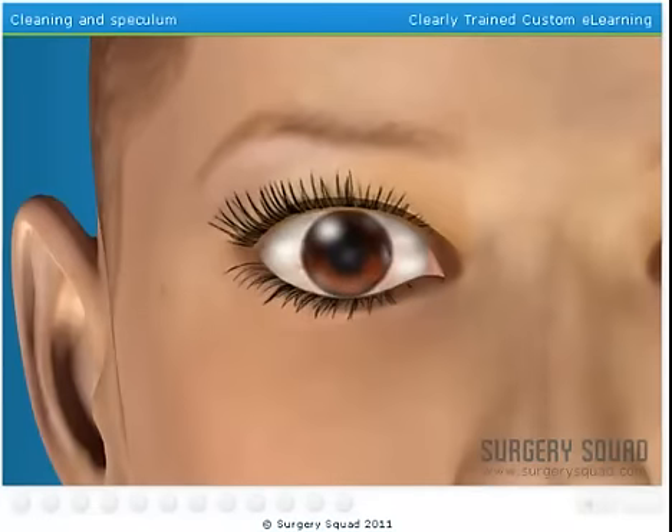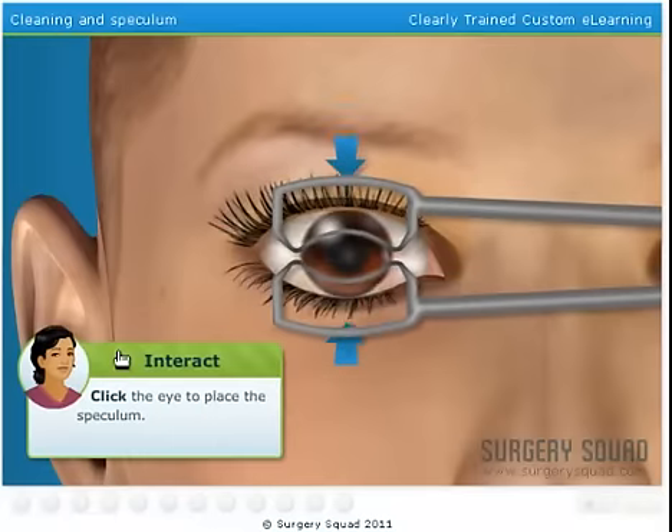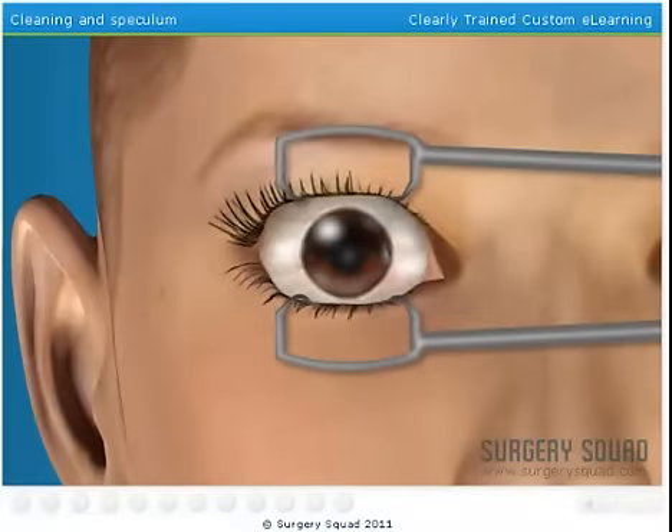Now that the area around the eye is clean, we'll use a device called a speculum to hold the eyelid open wide. So let's get that speculum over the eye. If the patient was allowed to blink, we might cut or burn the wrong area.